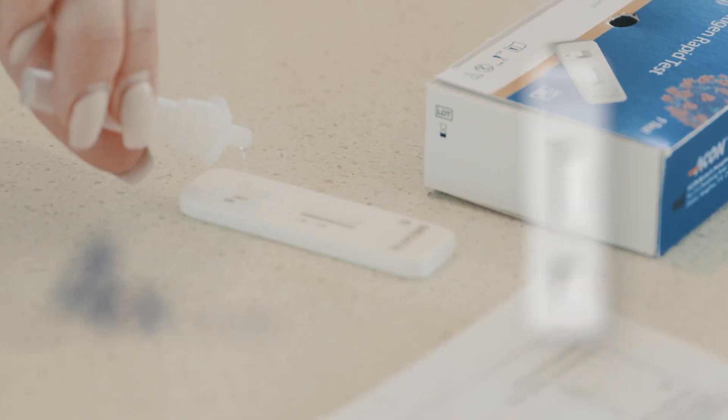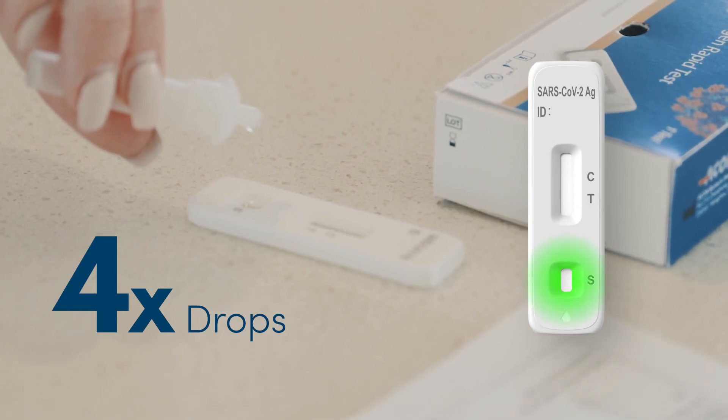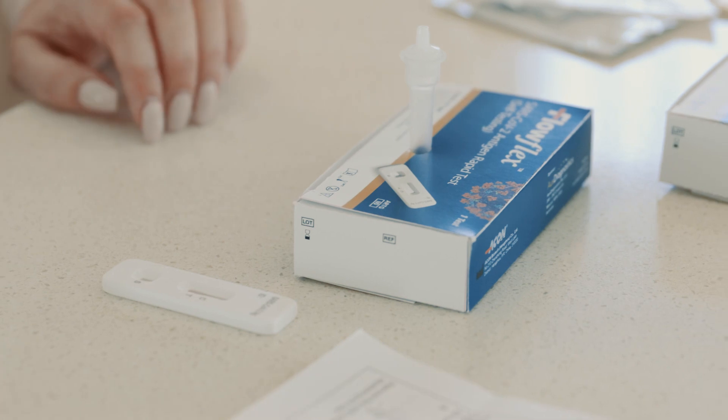With the cassette on a flat surface, gently squeeze four drops of the solution into the well labelled S on the test cassette. Place the tube back in the tube holder and keep this until the test is complete.